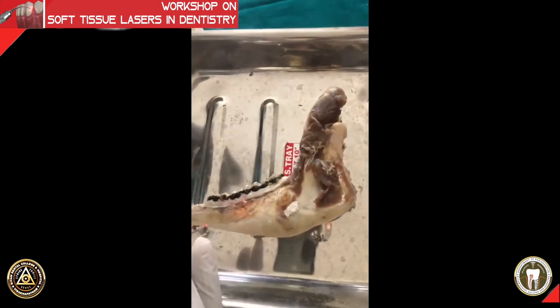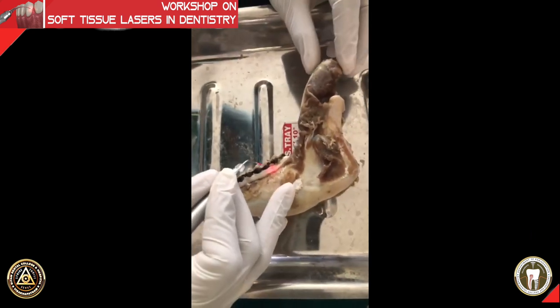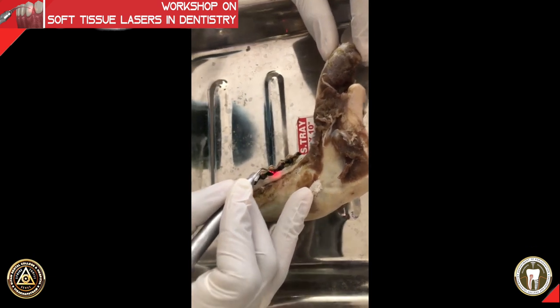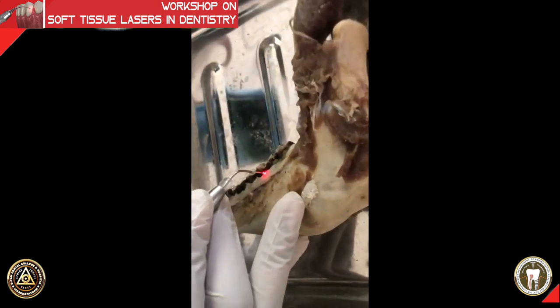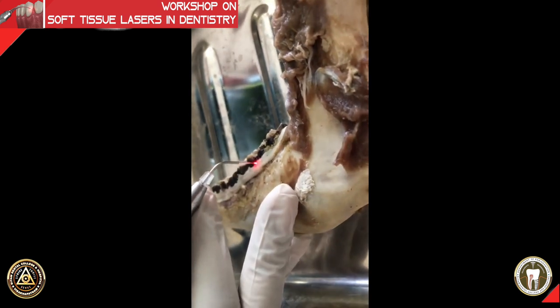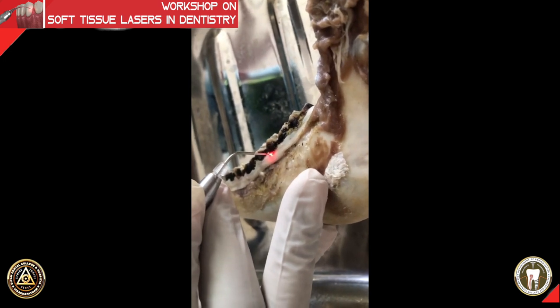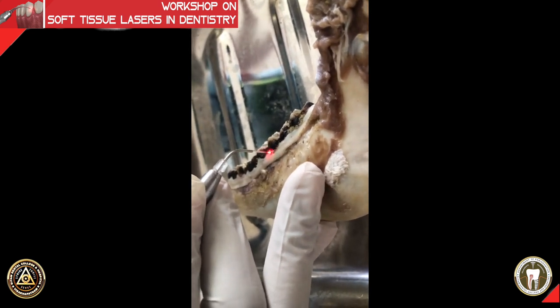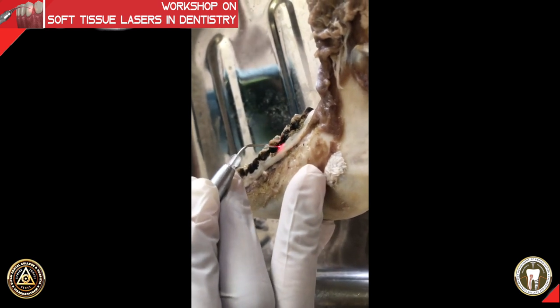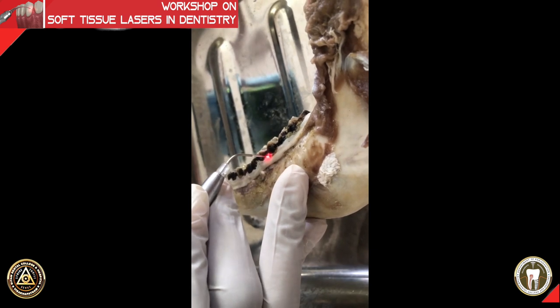We are going to work on one of the molars of the goat. You basically keep the tip at an angle of around 60 to 90 degrees to the tooth, with light contact on the soft tissue. Use light contact and give repeated strokes — don't try to remove the gingiva in one shot.